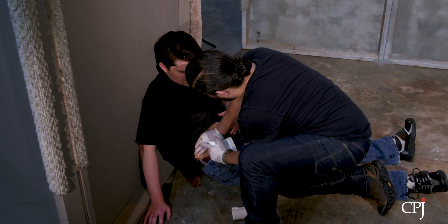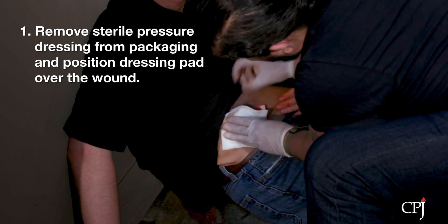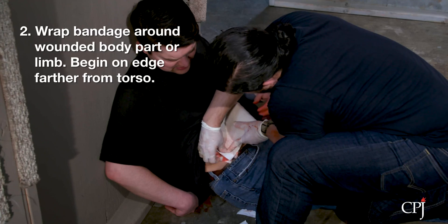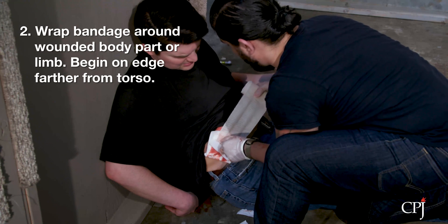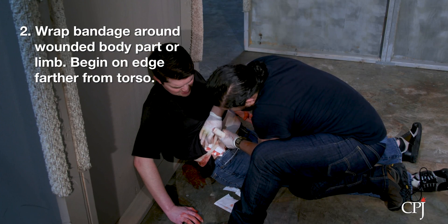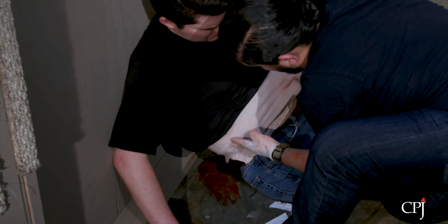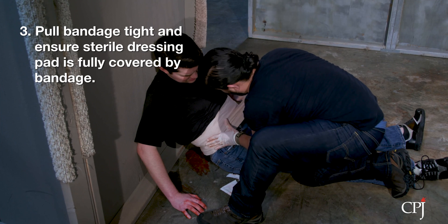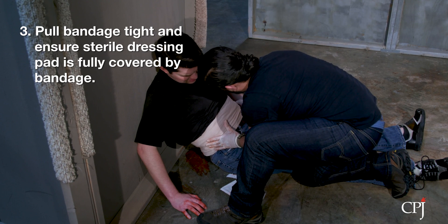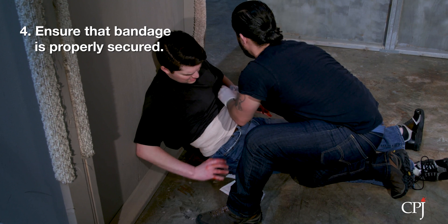Generally, to use a pressure dressing, remove the pressure dressing from its packaging. Position the sterile dressing pad over the wound. Wrap the bandage around the wounded limb or body part, beginning on the edge furthest from the torso if possible. Pull the bandage tightly and ensure that the sterile dressing pad is fully covered by the bandage. Ensure that the bandage is properly secured.